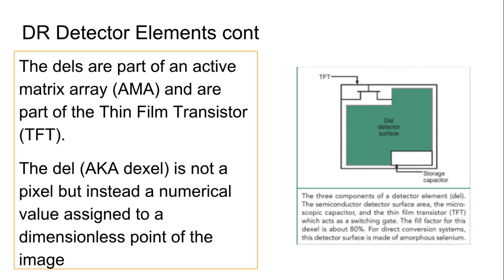They are numerical, so the computer knows where they are and they're tagged in such a way, but they're known to be dimensionless points of the image. Of course, they are certainly related to the image that you see, so there is a tie to the contrast or brightness level that is attributed overall to the pixels in your image.